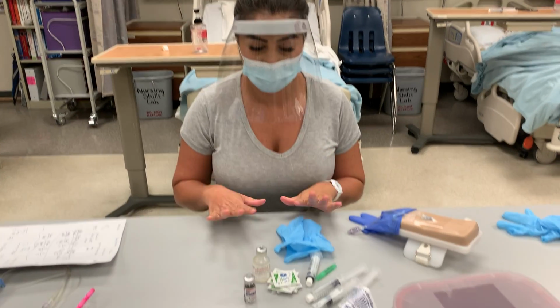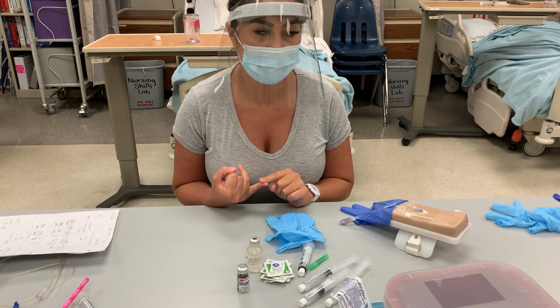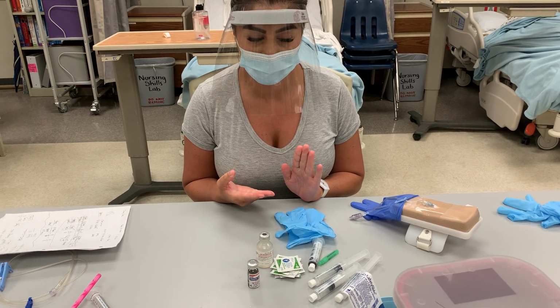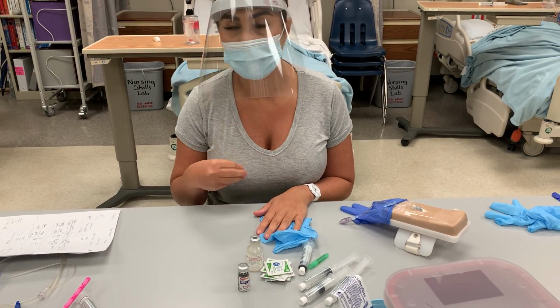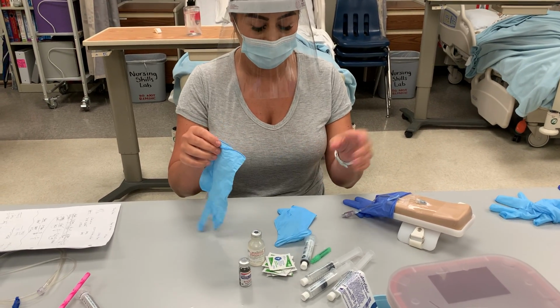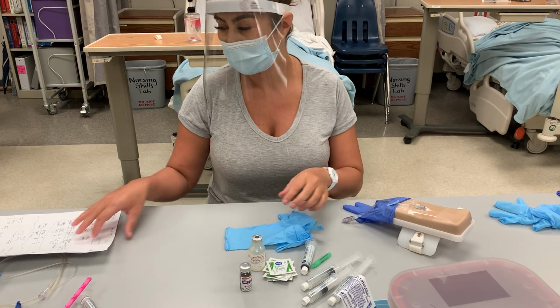Okay, prior to getting my medication, I would have done a focused assessment on my patient, verified if they had any allergies, and then taken vital signs. In this case, I'm going to be giving morphine, so I would have asked the patient for their pain on a scale of 1 to 10. What was their pain? So now I'm going to go to the med room, and now I'm in the med room, and I'm going to get my medication.